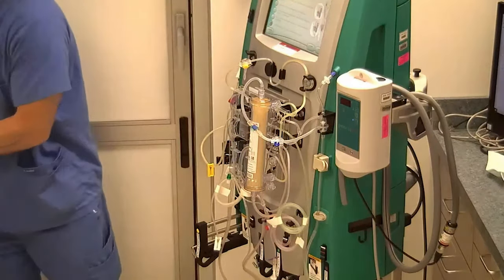During treatment, the reason why we want to check this every once in a while is if the fluid level, if the blood level gets too low, it's going to drop below our return line going back to our patient, and we're going to suck unwanted air into the line, and the air sensor will detect it, and then the venous clamp will lock down.